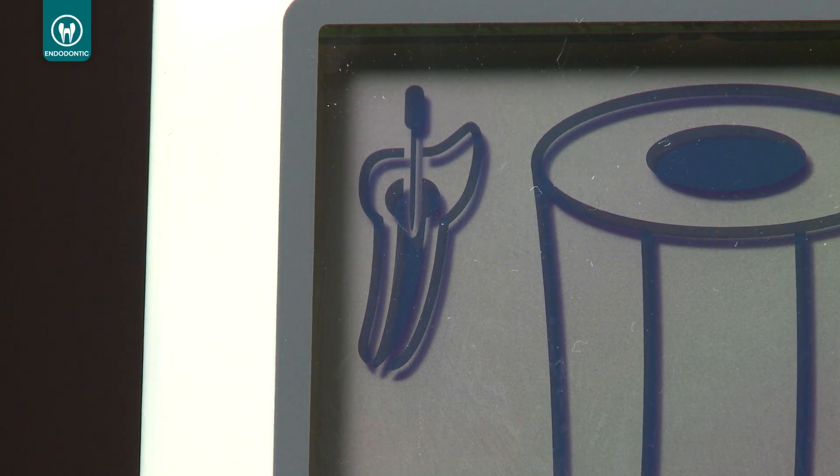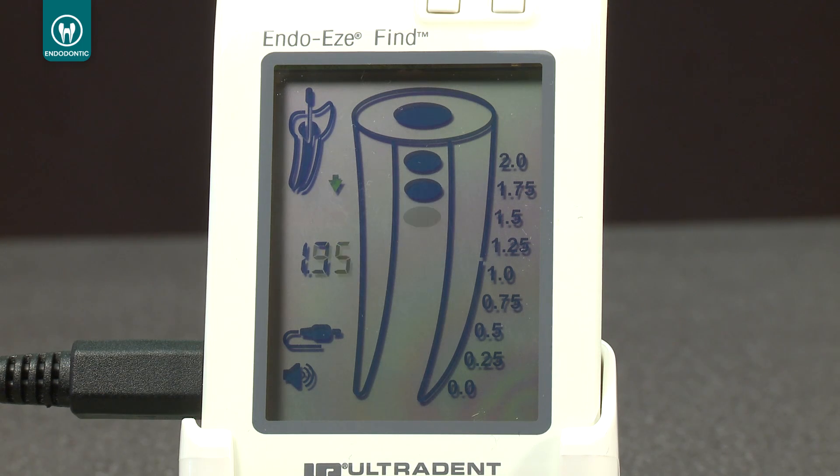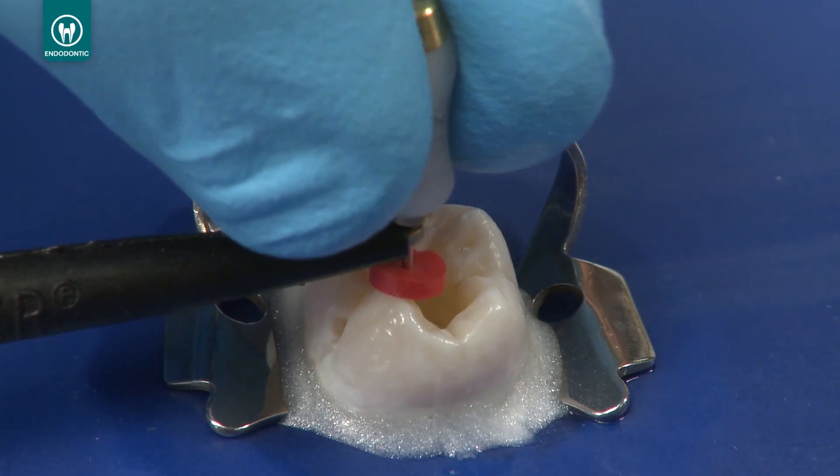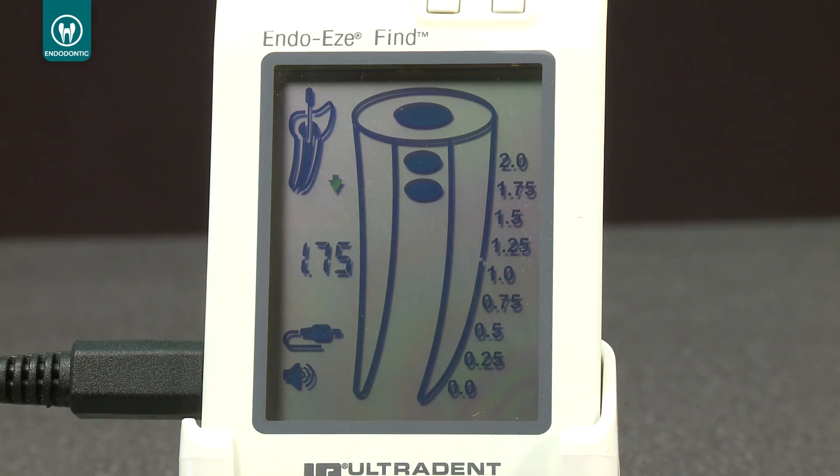If the electrical contact is good and the conductivity of the root canal is sufficient, the file icon inside the small tooth image will stop blinking and a double beep audio signal will sound. The Find Apex Locator will now display the distance from the file tip to the apical foramen. Slowly advance the file towards the apical region, continuing to move it smoothly in a watch-winding motion. As the instrument progresses towards the foramen, color segments inside the root canal image and audio signals with different frequencies will indicate the file's progression.